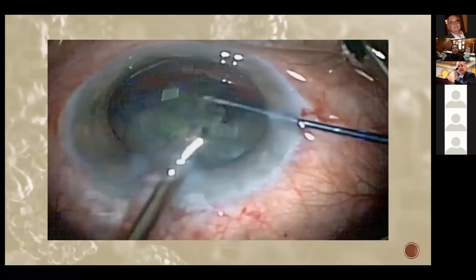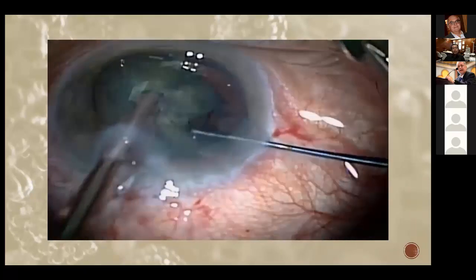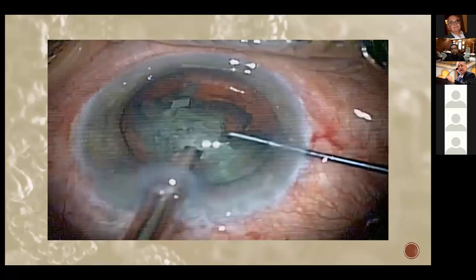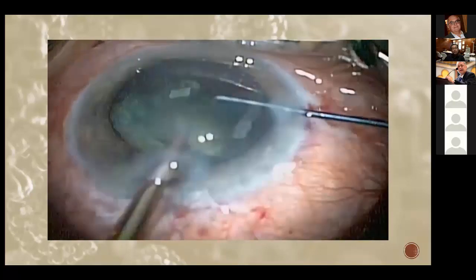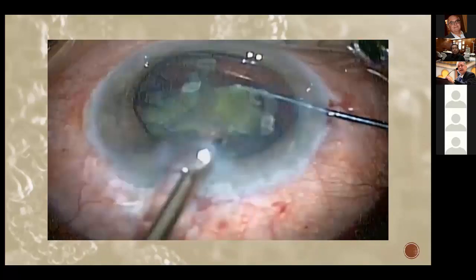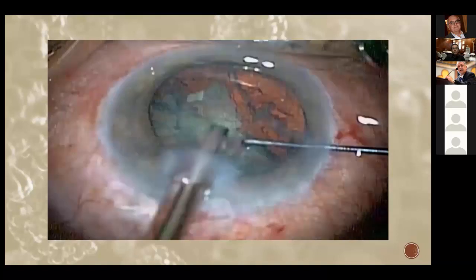And so the trick here is I don't want to do high resistance rotation while the whole nucleus is there. Once I have fragments out, the rotation is inside the bag without any friction on the bag. So it doesn't exert pressure, a rotational or torque pressure, on the zonules and tear them more. And that pressure is always distributed on all the zonules that are not torn, and that's because of the capsular tensioning that I have.